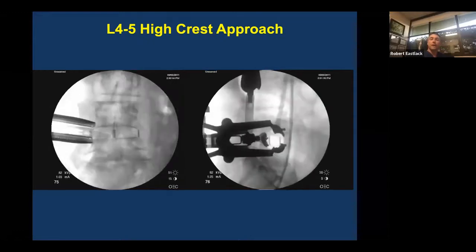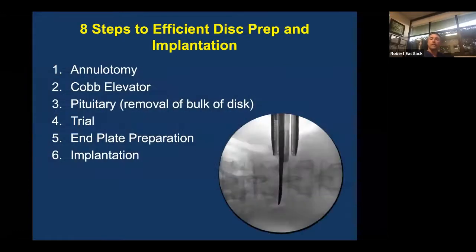Then you can place your final implant. This is an older PEEK implant, but efficiency is king. Aim for no more than 20 to 25 minutes of disc prep and implant placement time. For your annulotomy, I like two vertical cuts first — one ventral, one posterior — leaving a small cuff of one to two millimeters in front of the retractor assembly to prevent it from sliding forward. Two vertical cuts define the 15 to 20 millimeters of space you need for your work, then cut right along the end plates. Once you've done that from anterior to posterior, go straight to your Cobb elevator. It's tempting to go to the pituitary first, but you can save time by going straight to the Cobb — delaminate the disc off the end plates cephalad and caudad, then go to your pituitary and debulk the majority of the disc, but do not worry about the end plates yet.